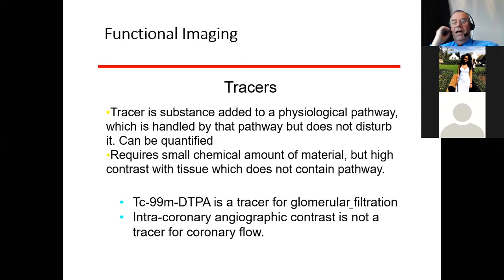And DTPA is a classic example which we can use for glomerular filtration. But you can't say the same, for example, for intracoronary tracers in CT or in angiography, because these injections are quite thick, have a high viscosity, and they can actually change flow.